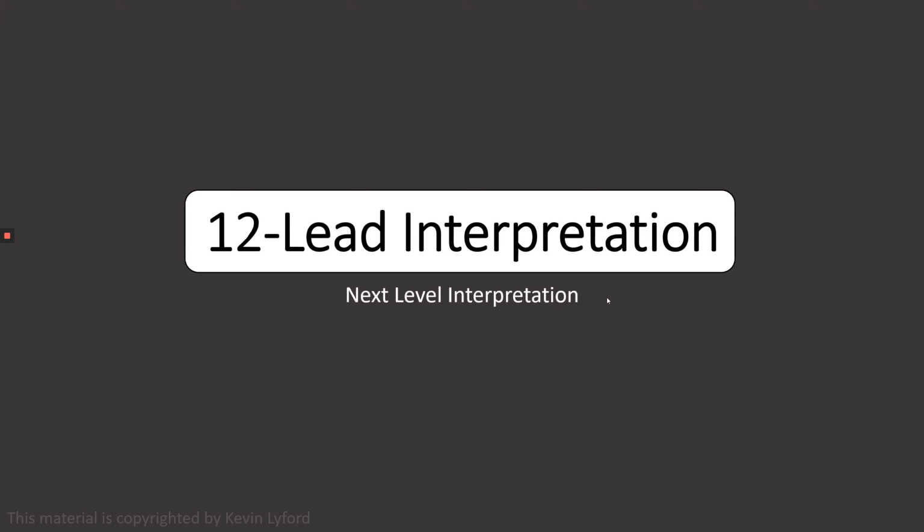All right, so today we're going to cover Sgarbossa's criteria. This criteria is one of the more complicated criteria. It's also one of the more complicated ones to say when you read it. But we're going to take a look because it's a pretty relevant one, fairly important. So let's dive right in.